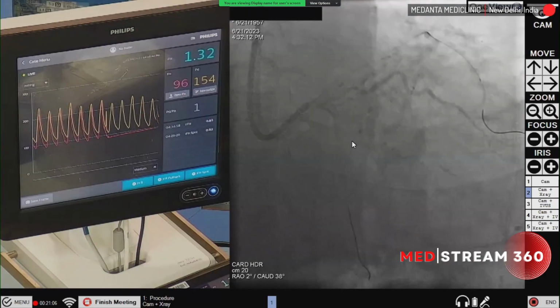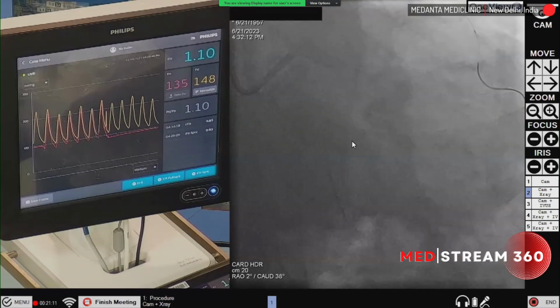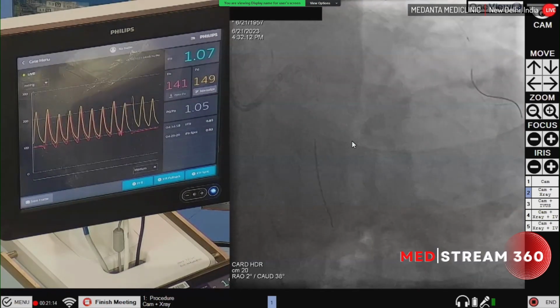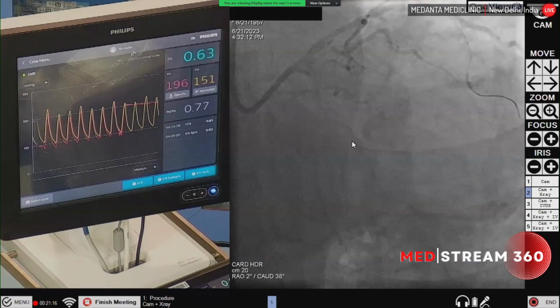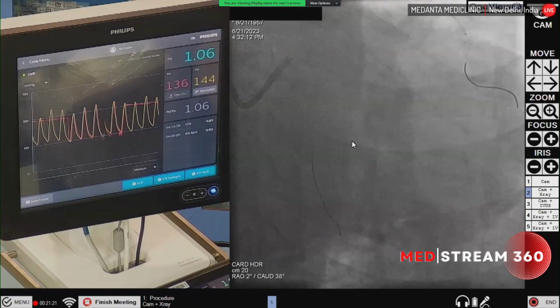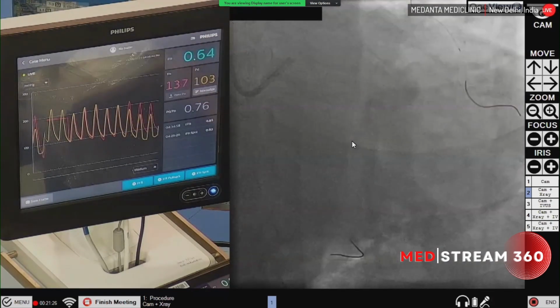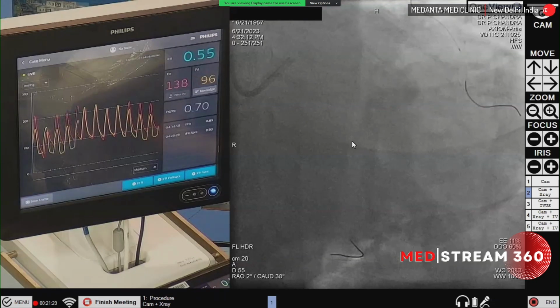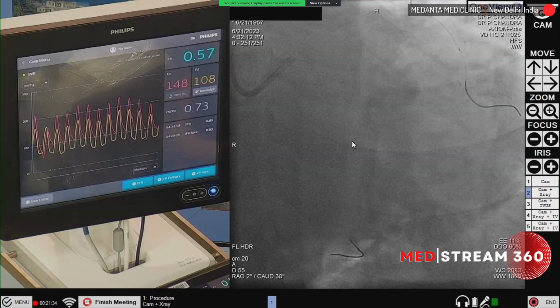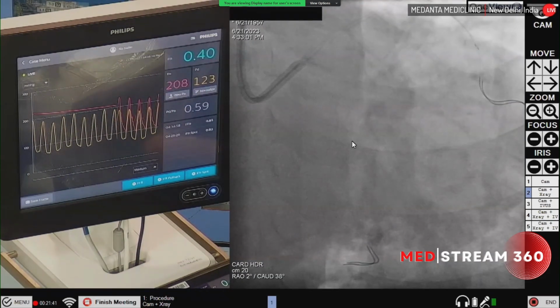Check, please. No, I can't see distal, anything. Great. So we have put the wire in the circumflex. Okay. So let's look at the values here. This is significant. So this value is significant here. As you can see, it is coming to about 0.6.